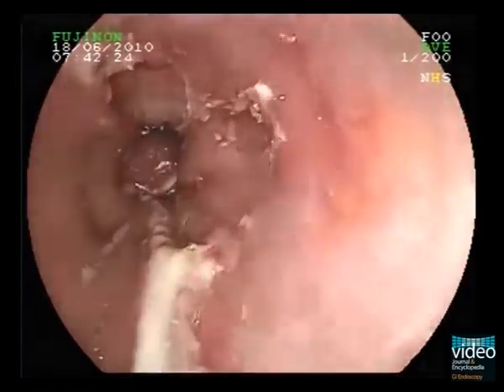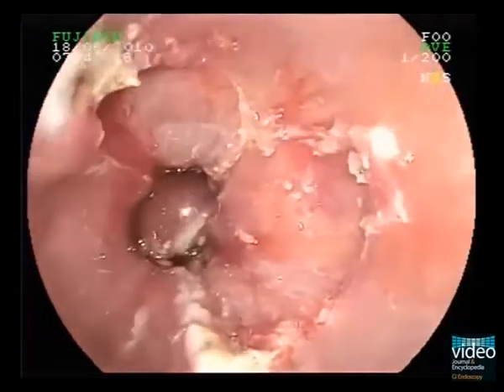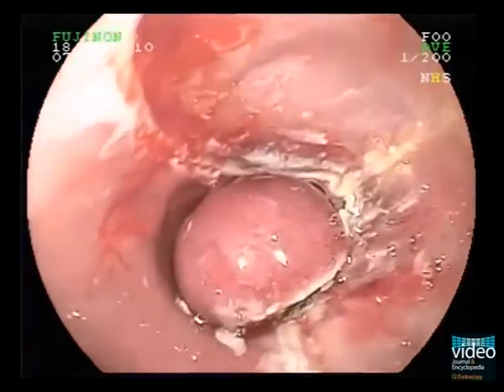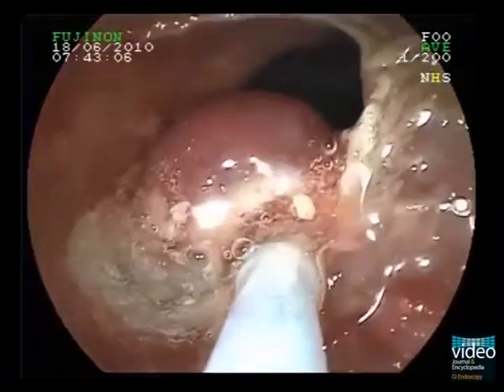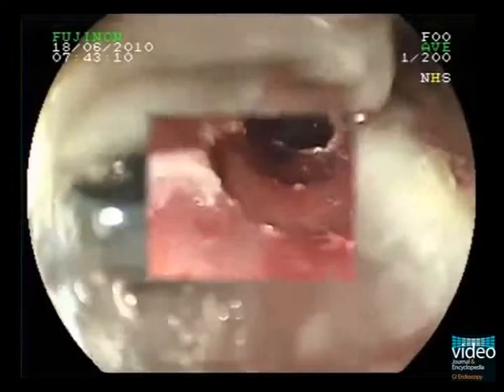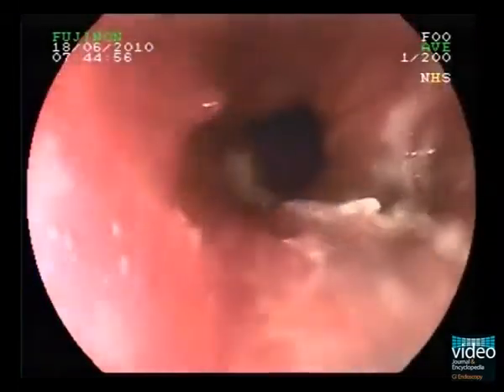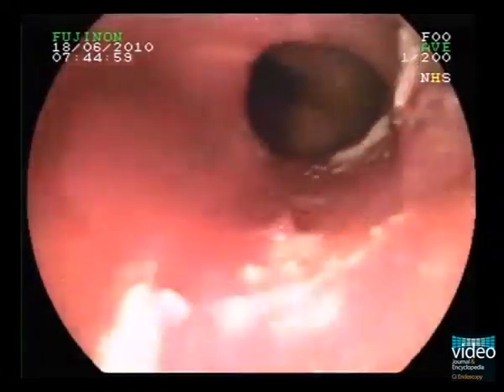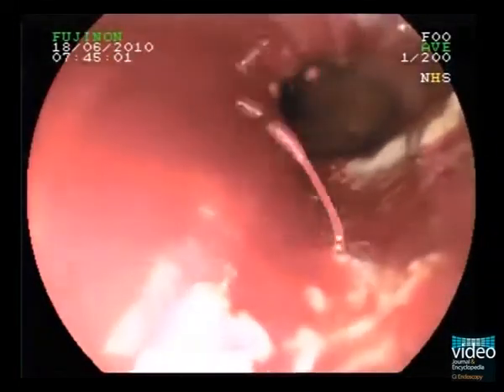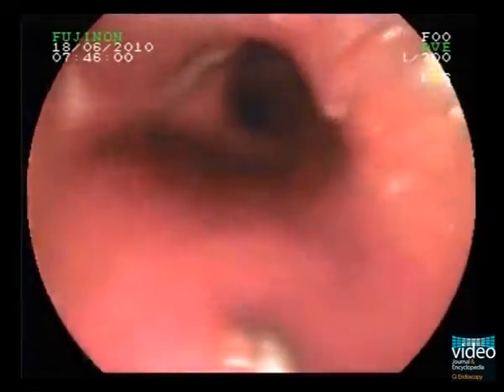After the 4th resection, you have a nice view onto the muscle layer without any residual neoplastic tissue. The 5th resection resulted in a spurting bleeding from a submucosal vessel. A clip is placed onto the bleeding vessel under endoscopic view.